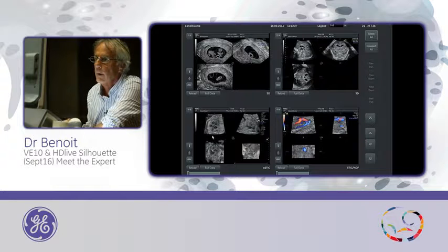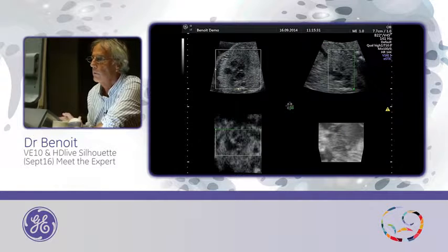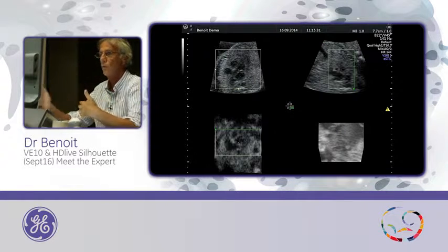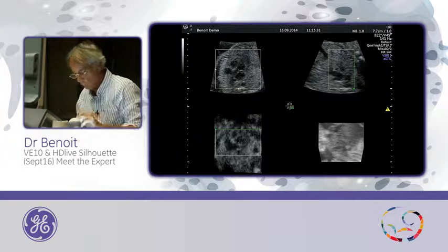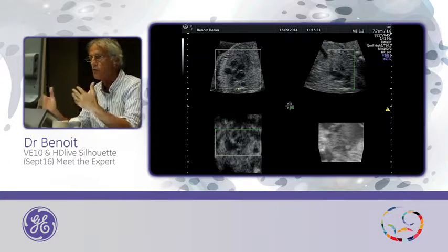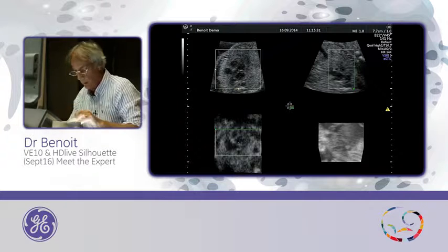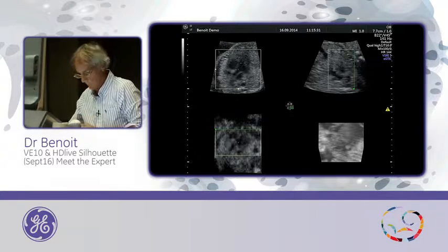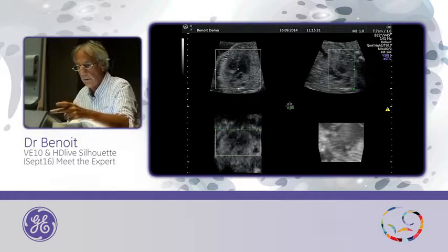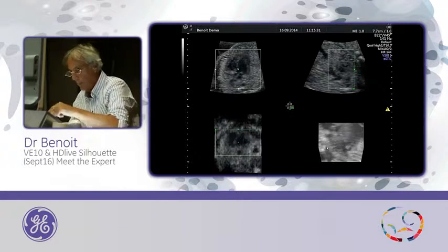Okay, so the last one, maybe you saw in my lecture a heart with the view from the back, and it was this case, and I will try to reproduce because sometimes you do some nice picture, it's difficult to do it again. So this is a STIC. I start. And this is a result with a gray here.